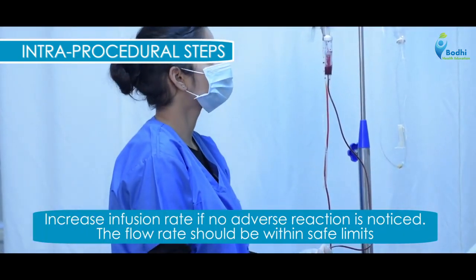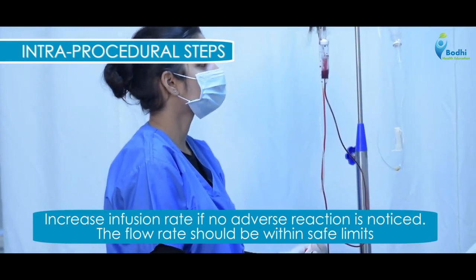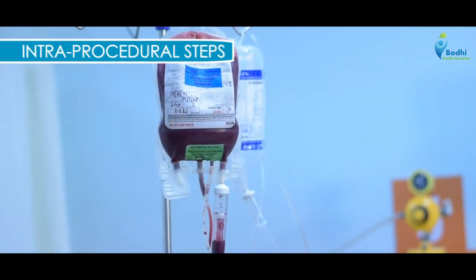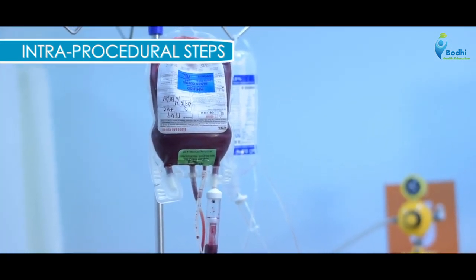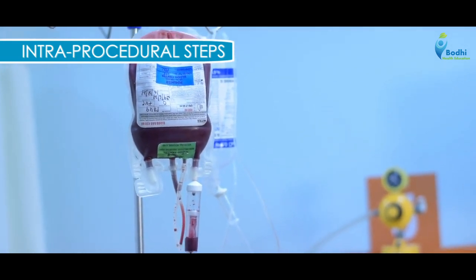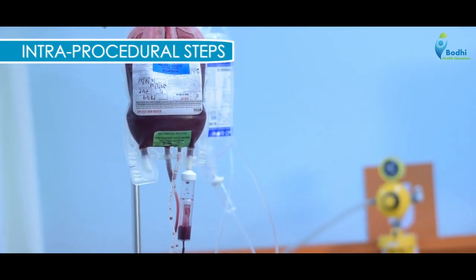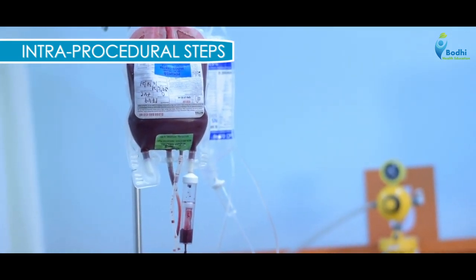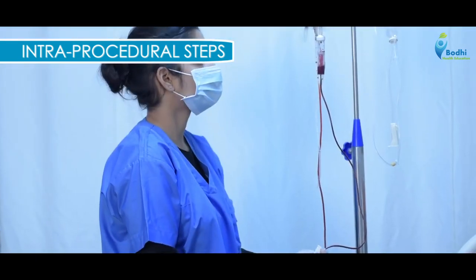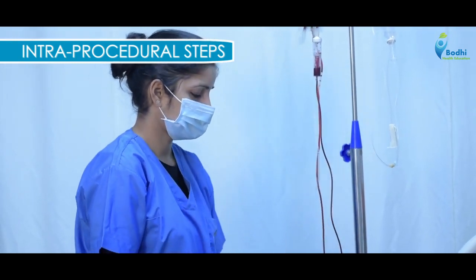Increase infusion rate if no adverse reaction are noticed. The flow rate should be within safe limits. Signs of a severe transfusion reaction, that is acute hemolytic anaphylactic, are usually manifested during infusion of the initial 50 to 100 ml. Flow rate is determined by physician's instruction and patient's condition.